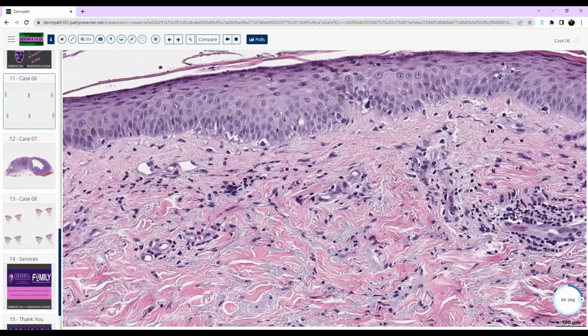You're saying there are or aren't? Well, we did see a few in here. I agree with you. But if you start looking at that, and then you start looking down at your answer choices, and you see eosinophils, and you say, gosh, I saw some eosinophils in there. Tinea, bullous impetigo, psoriasis, AGEP, those things are all in the differential. Is that going to throw you off?